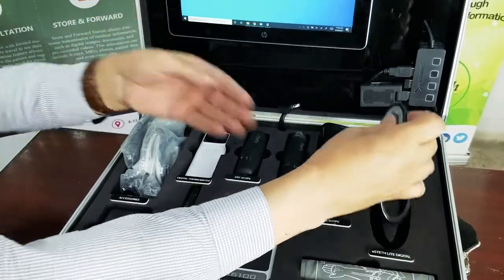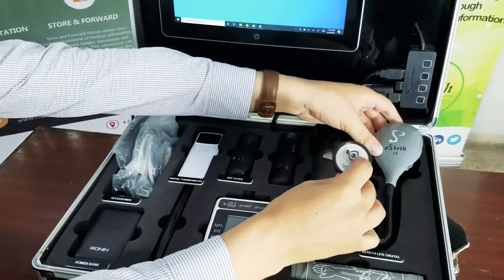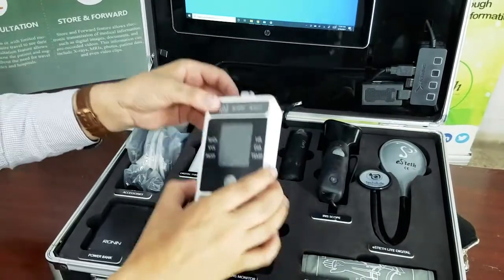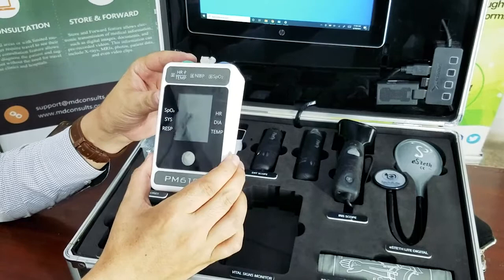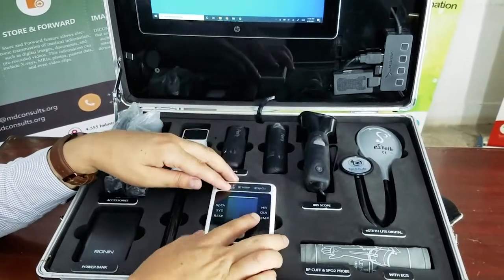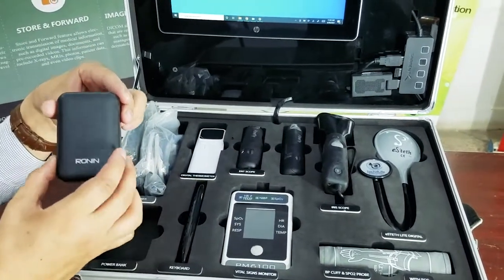Next is a digital stethoscope to convey the sounds from the heart and lungs of the patient. The next device is a vital signs monitor, which helps you measure a number of vital signs and transmit them to the physician. The kit also comes with a power bank.